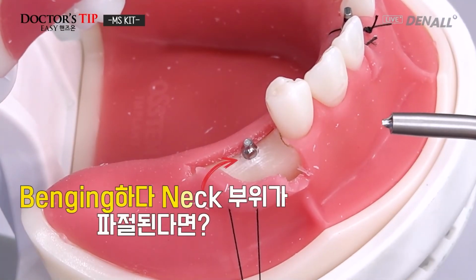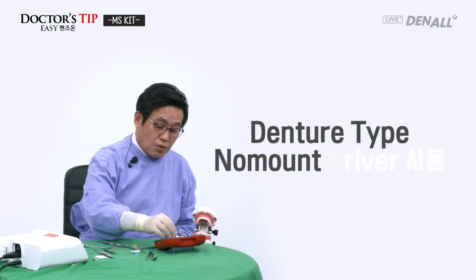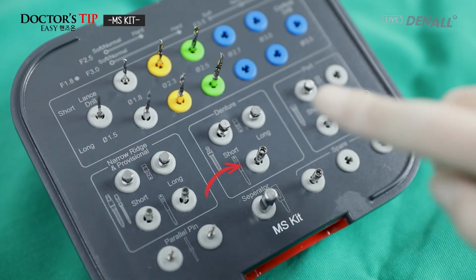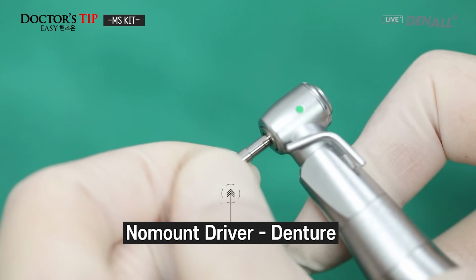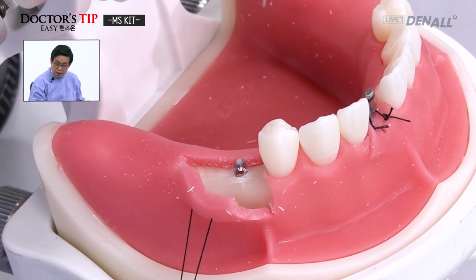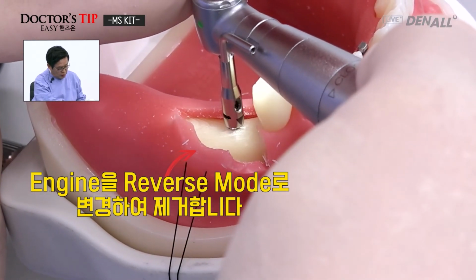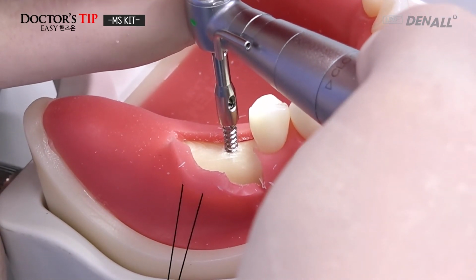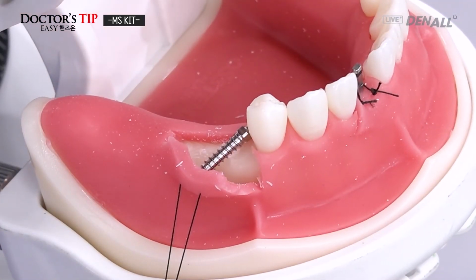But if bending results in such a fracture, then there is the denture type fixture driver, besides the no mount driver. For denture, you can use this. You connect, and you have a hexagonal nut on the provisional bottom side. So you push this in the reverse mode, then it can be easily removed. So while using a provisional, if there is a fracture, using this denture type, you can easily remove the fixture.